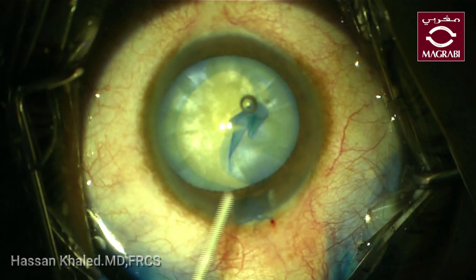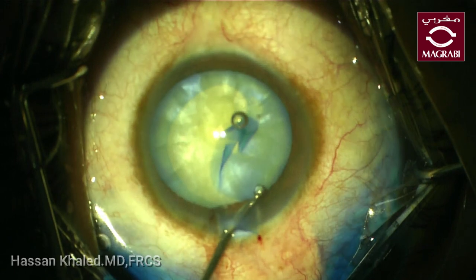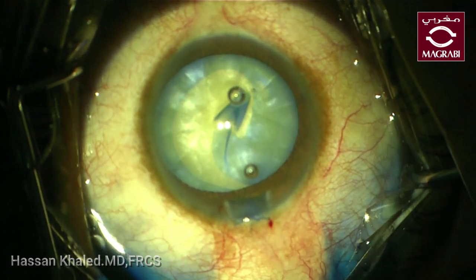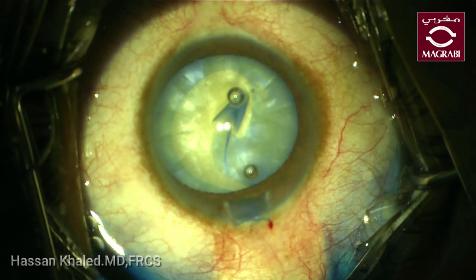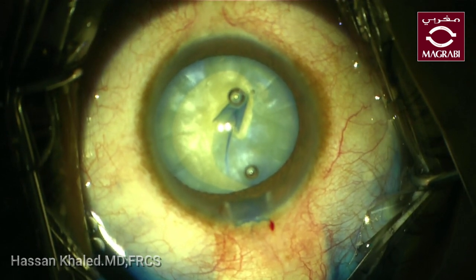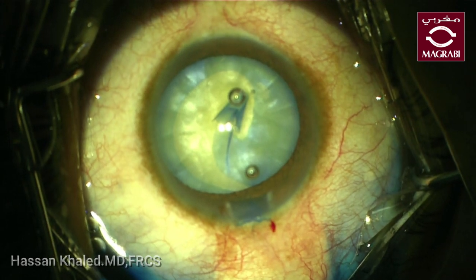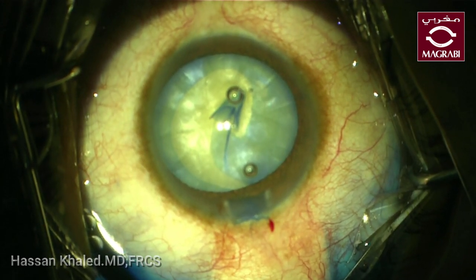Now I will inject OVD to see the edge of the extension. I can't see the edge of my extension and I don't know if this extension goes anterior or posterior to the equator and whether it is affecting the posterior capsule.